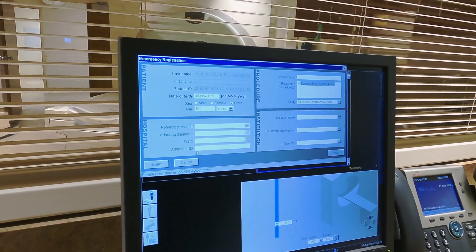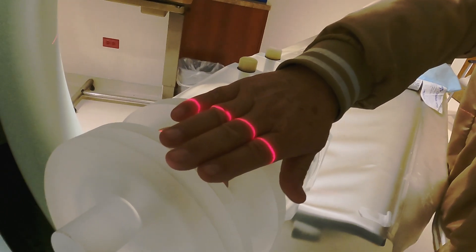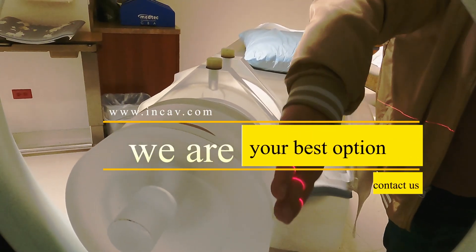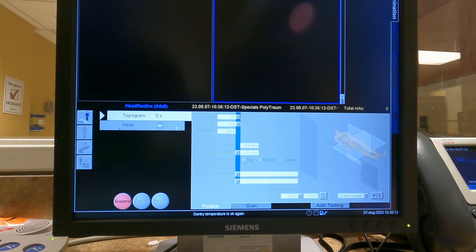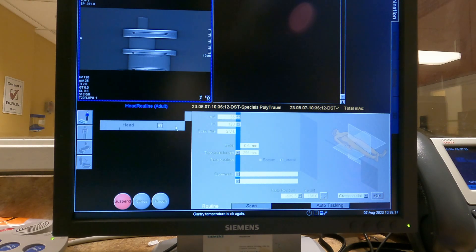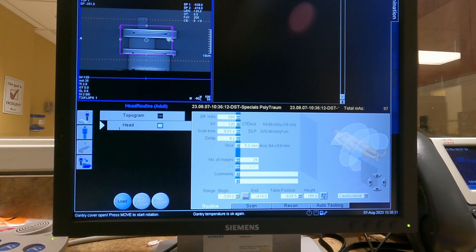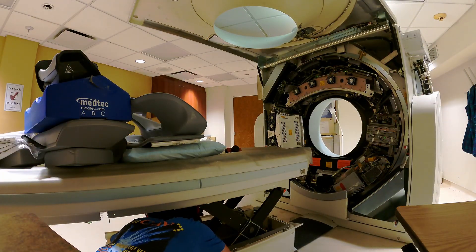There are several reasons why the Siemens Somatom Sensation 64 CT scanner is one of the most installed 64-slice scanners in the world today: speed, performance, and resolution, to name just a few. The Somatom line is one of the best on the market, and the Sensation 64 model is truly top of the line. It is simply one of the fastest CT scanners you can buy, but its incredible speed does not mean you have to sacrifice image quality.